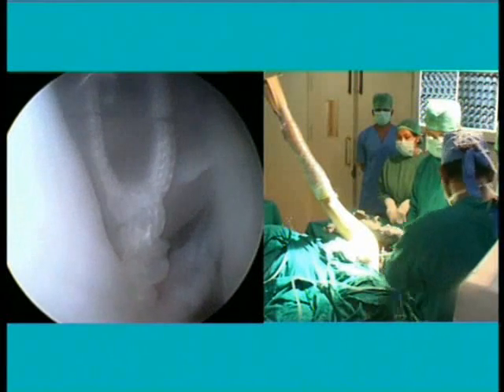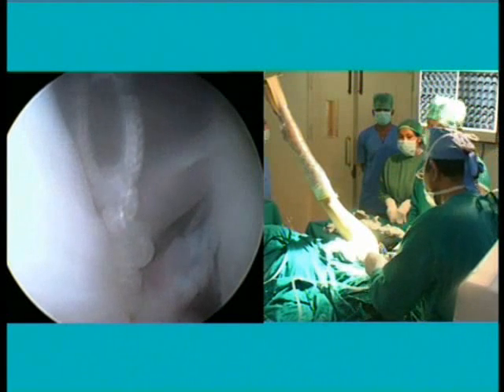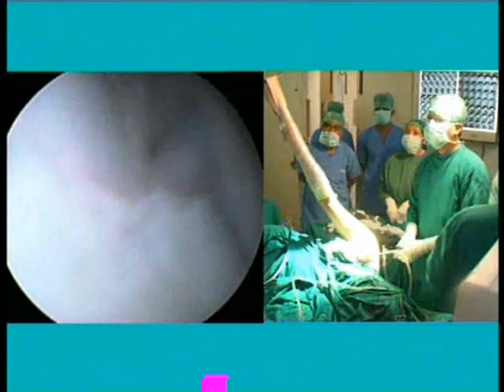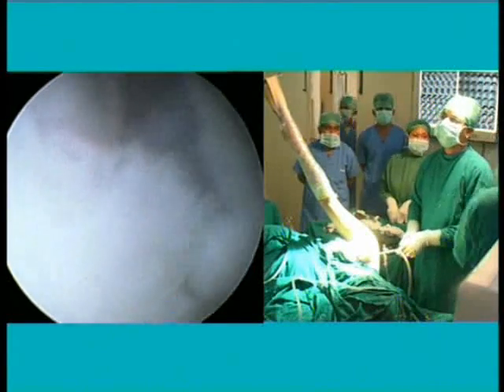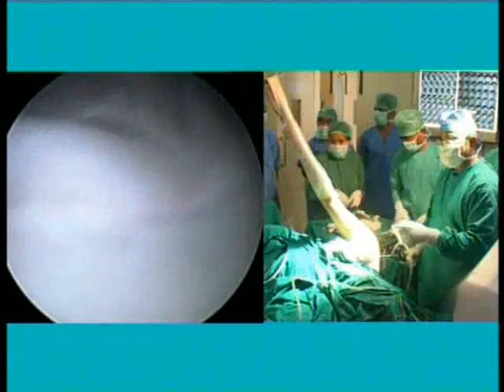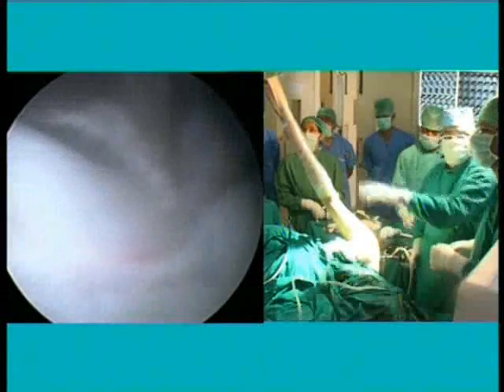So that is the dog bone. This is an Arthrex product. You can see it is curved and has two slots. The fiber tapes are being put into it. You can see how it can slide into this little socket.